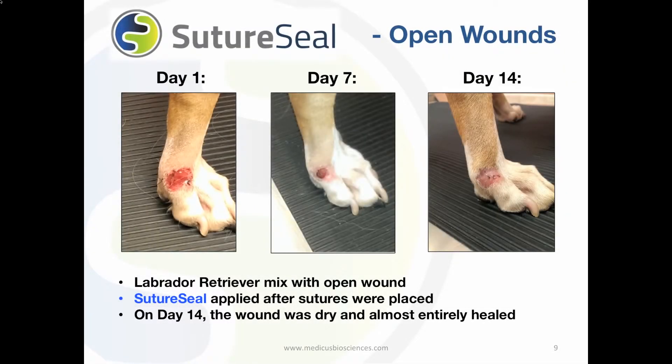Let's look at some before and after pictures of SutureSeal on open wounds. This Labrador retriever had an open wound on her paw. SutureSeal was applied and the pictures were recorded on day 7 and 14 after application to show the healing process.